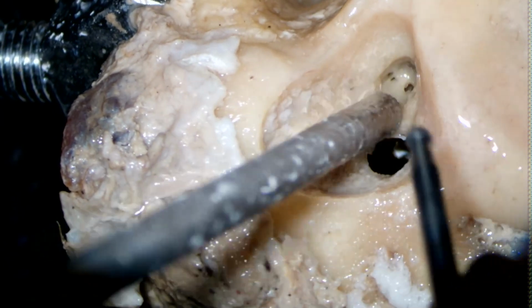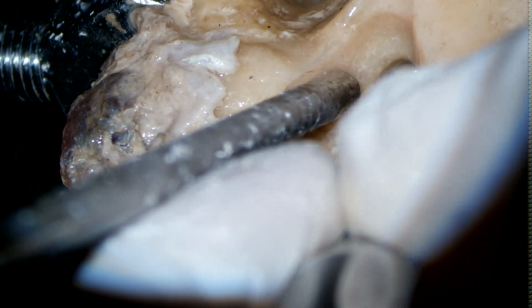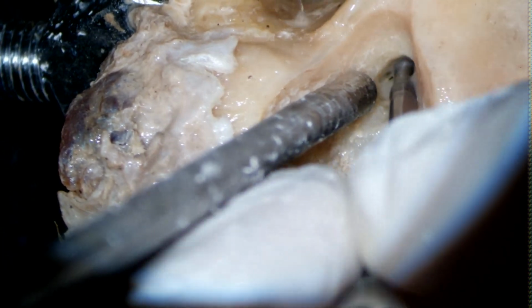So you can see that I am trying to enlarge the cavity and then try to find the aditus.